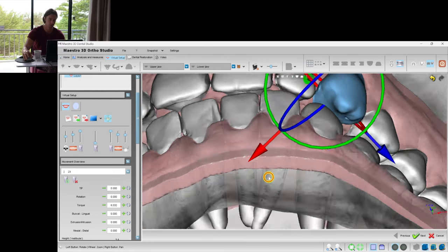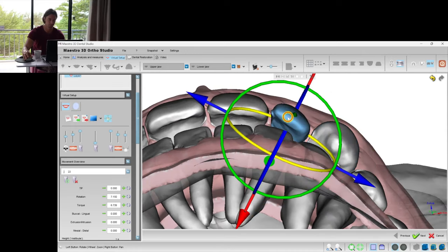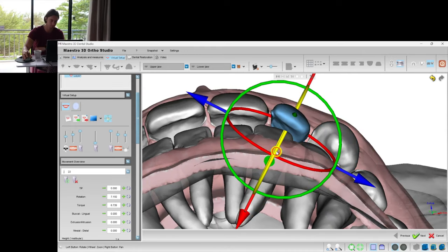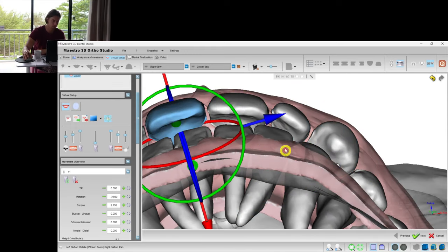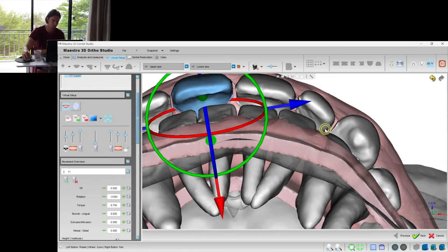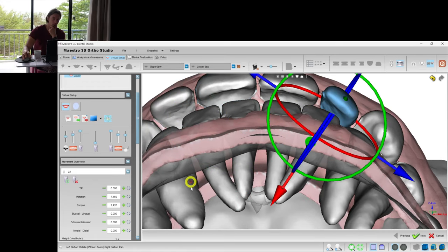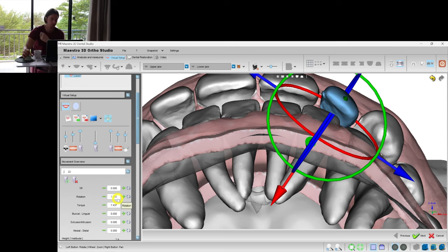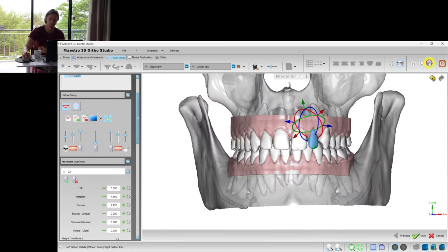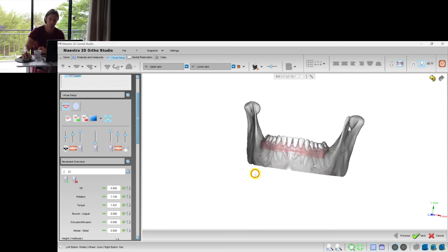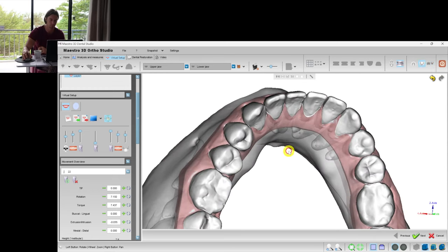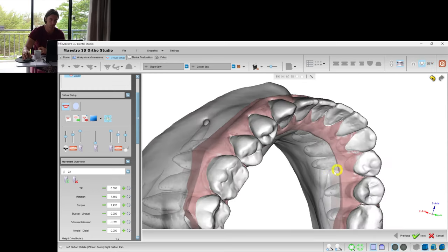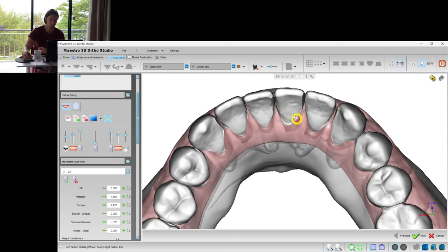Let's add some correction. Here, when I'm looking at the numbers, I always check that rotation goes in combination with the proclination, with the torque movement. Otherwise, it doesn't work as predicted.